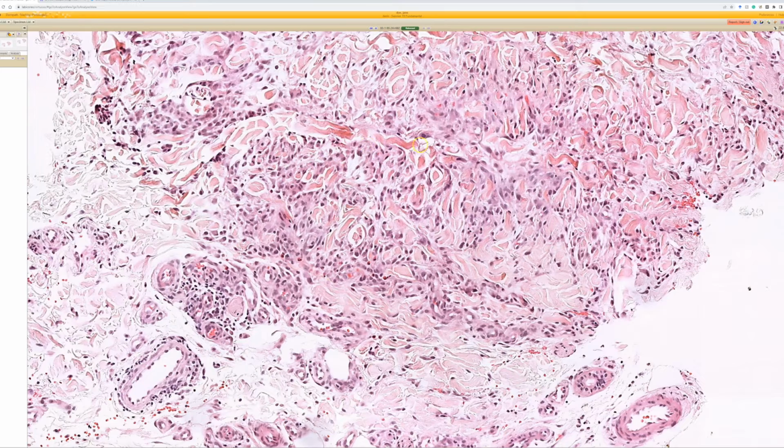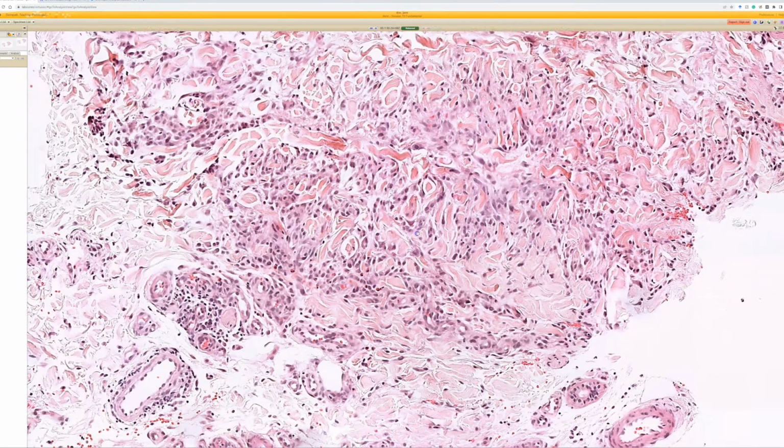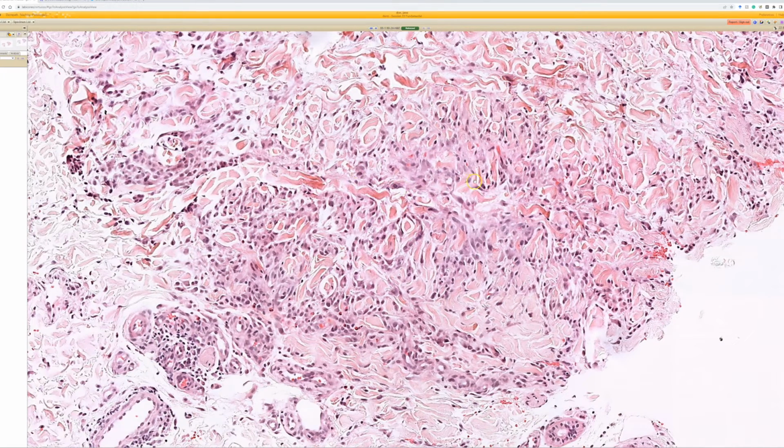The histiocytes in Granuloma annulare are often vaguely aggregated rather than tightly formed into tight nodular granulomas like we saw in that last case of foreign body granuloma, okay? So that's one important thing to note, that it's granulomatous, but the granuloma here is not your beautiful classic granuloma of like sarcoidosis or tuberculosis or a foreign body reaction. The granuloma in this entity is much more vague, subtle, kind of lazily grouped histiocytes.